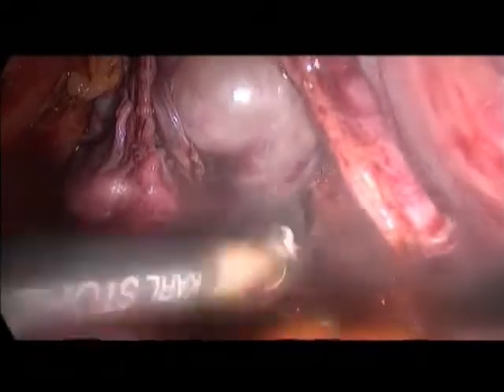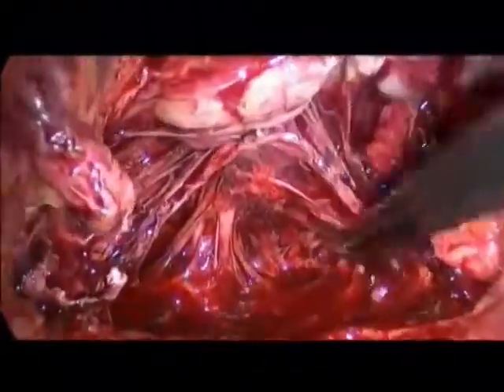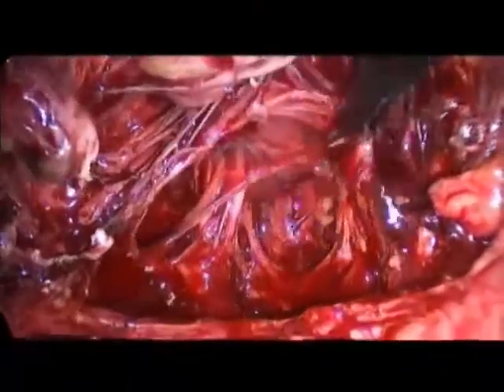Okay, so we always put a drain behind the suture.